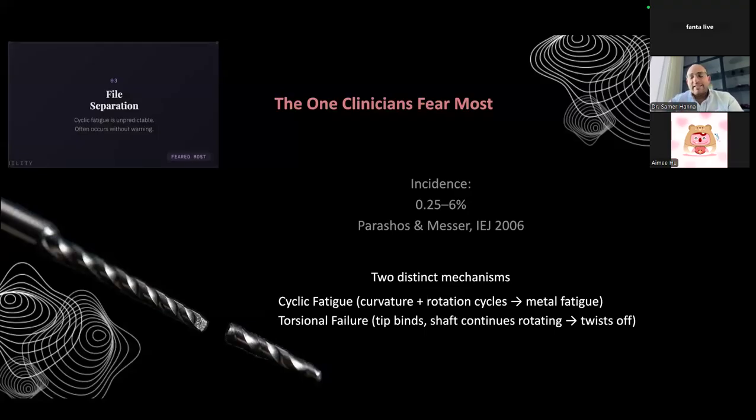We say this is easier to retreat, as the file wasn't really bound to a specific area, and didn't rest in the dentine in a hard way.